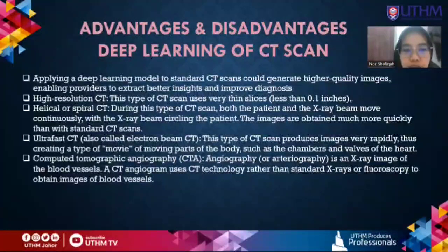Next is computed tomography angiography. Angiography or arteriography is an X-ray image of the blood vessels. A CT angiogram uses CT technology rather than standard X-ray or fluoroscopy to obtain an image of blood vessels, for example, the coronary arteries of the heart.